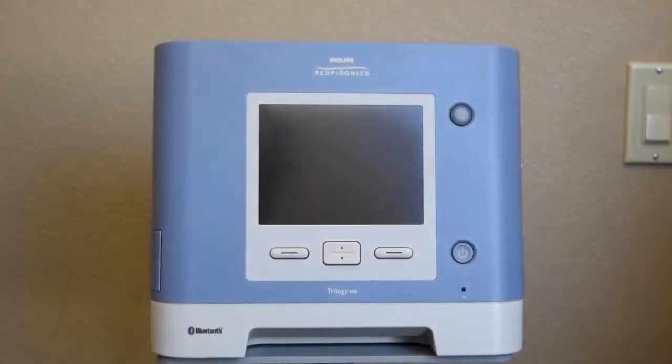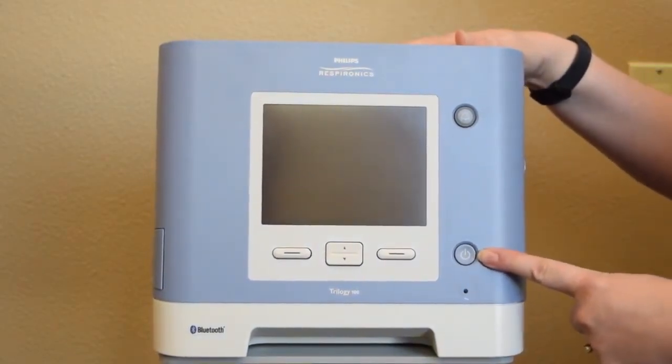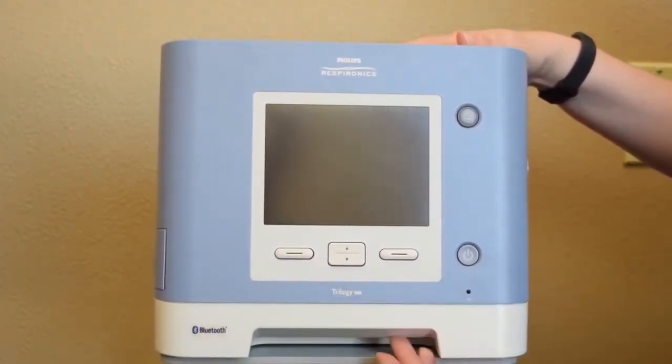This is the Trilogy 100. We're going to go over your front panel. This is the on/off button. This is the silence button. These are your menu navigation buttons, and down here is your alarm speaker.